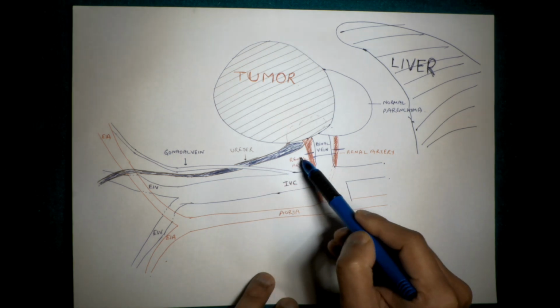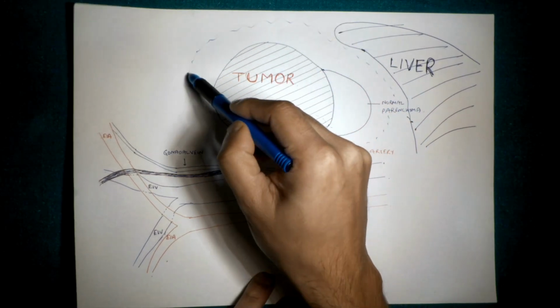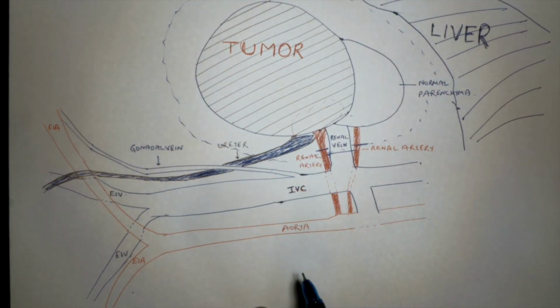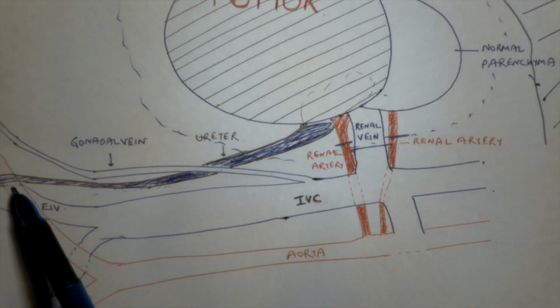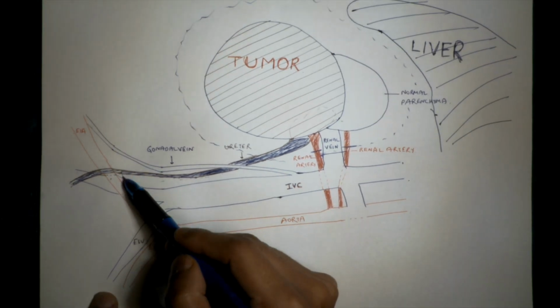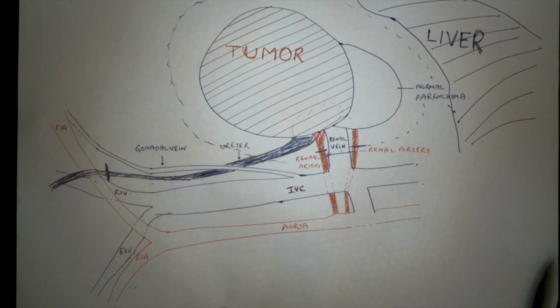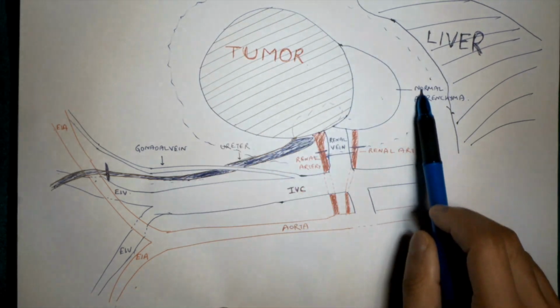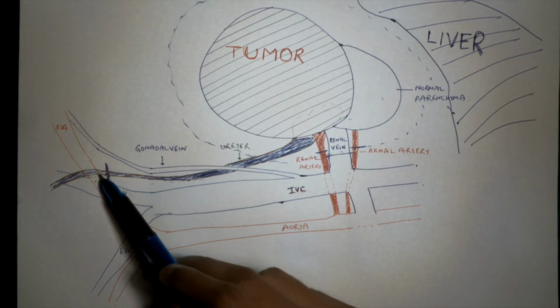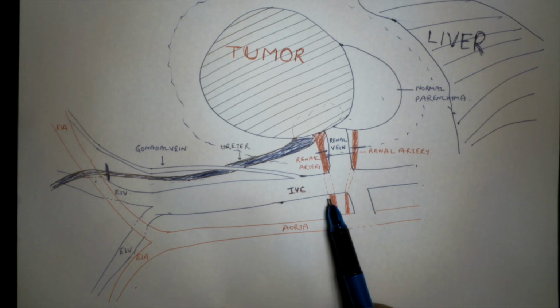Next, perinephric dissection is done to isolate the kidney along with the perinephric fat and the covering Gerota's fascia from the surrounding structures. After that, careful mobilization of the right ureter is done up to its distal extent and a clip is applied to the right ureter. Thus, this step completes the right radical nephrectomy and the specimen containing the kidney tumor along with the perinephric fat with the intact Gerota's fascia along with the ureter and the cuff of the renal artery and vein are removed.